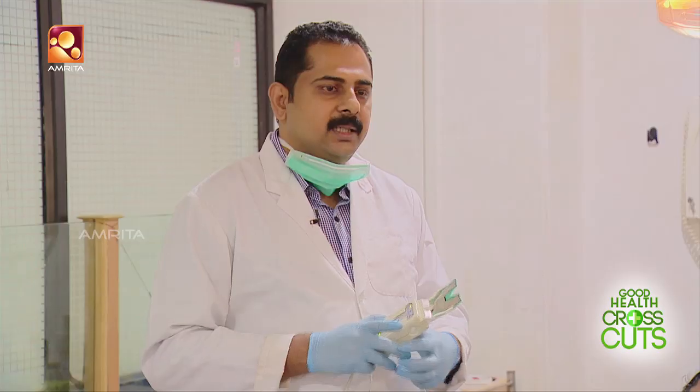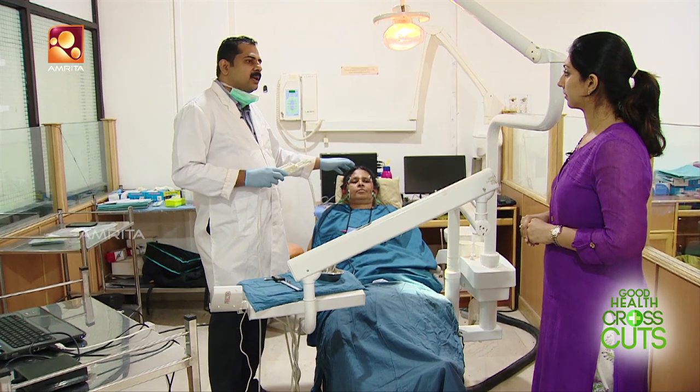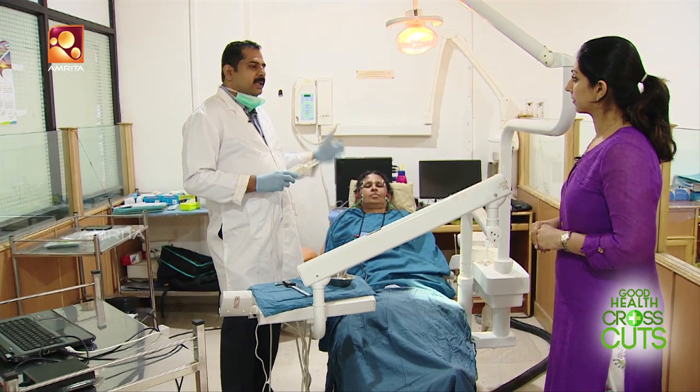This will be watched through the scan and studied, and we have corrected treatment based on that. This is a normal force — if we can manage that force, we can correct it. The pain will be reduced, which is why we treat headache patients with this approach.